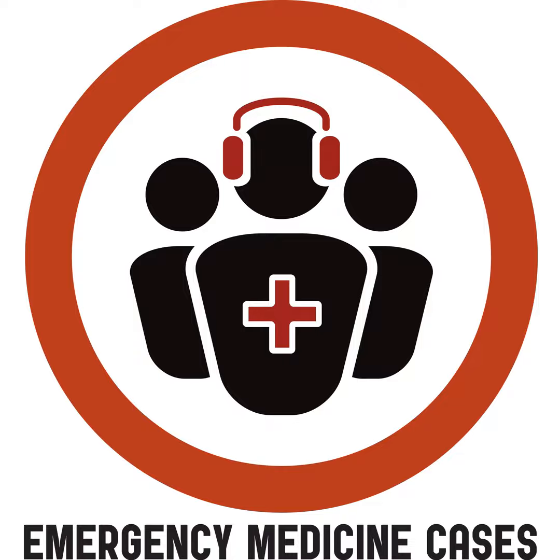And really the only case where I can see it being useful is in experienced hands. If someone told me I have a chance to evaluate the quadriceps tendon by ultrasound or with MR, given my experience and training, I prefer to evaluate with ultrasound because I can do dynamic imaging too. The beauty of ultrasound in skilled hands is dynamic scanning. I do believe strongly that knee ultrasound is one of the most overhyped things, and it does not need to be routinely ordered. I'll just leave it at that. Excellent.